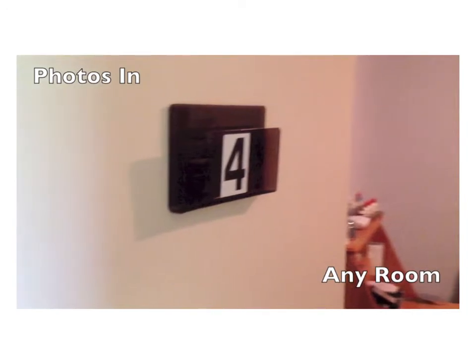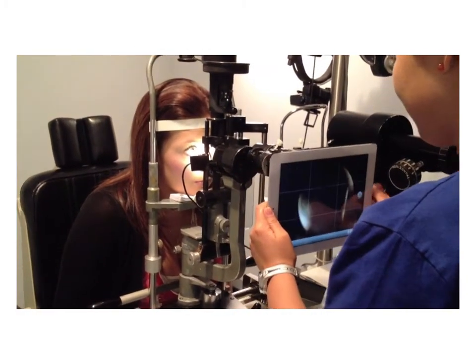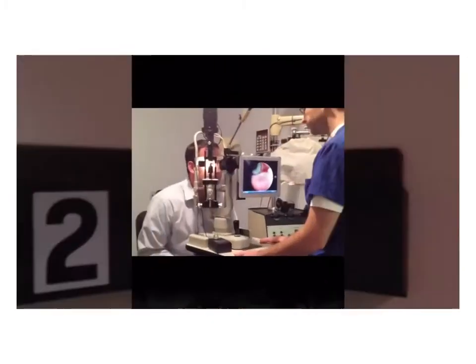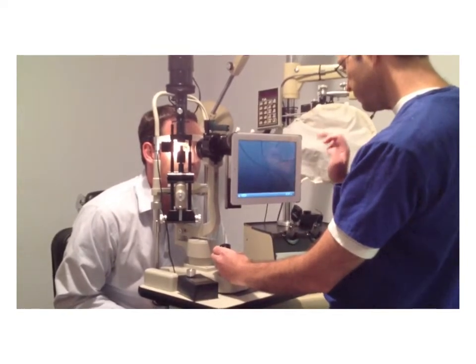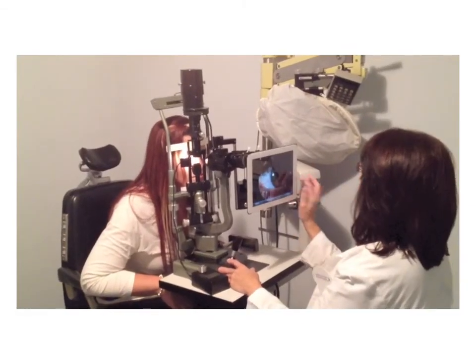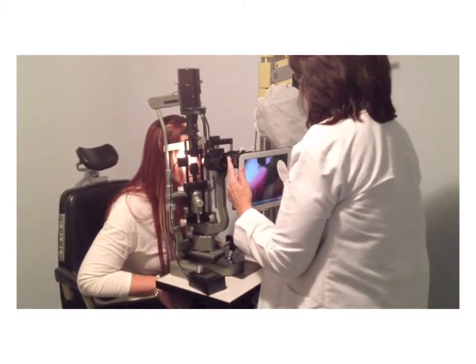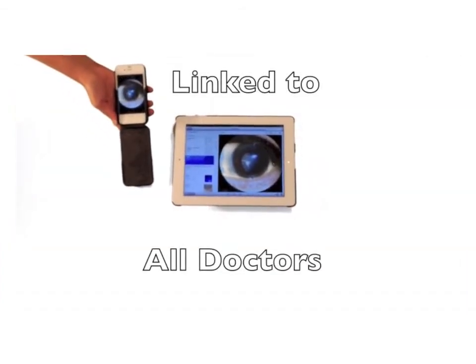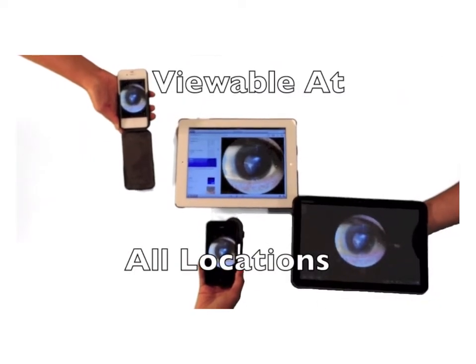Since the camera is so portable, it can be brought to any room and the pictures can be taken by everyone. You can use it in room two or in room six — always available, never miss a shot. Since the photos and videos are in the cloud, they are available to all doctors at any location.